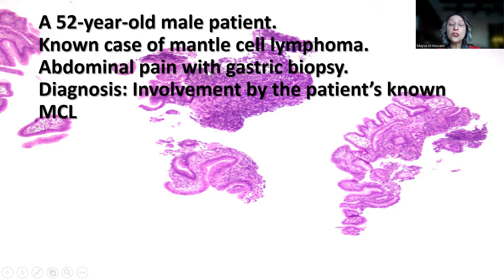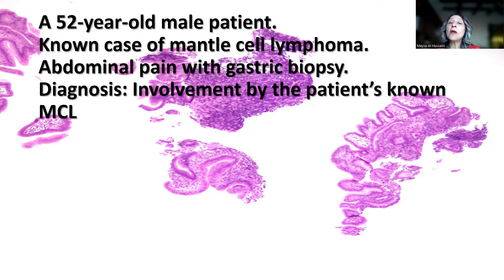Remember that the key tip from today's case is that a crushing artifact in lymphoid aggregates — anywhere in the bone marrow, in the stomach — you have to always be suspicious, especially if the patient is a known case of lymphoma. Then you can apply a selective panel of immunohistochemical stains that would point towards the diagnosis without going into extensive immunohistochemical staining. Remember that mantle cell lymphoma has a propensity to involve the GI tract — usually the colon in the form of polyps, but sometimes also the stomach.